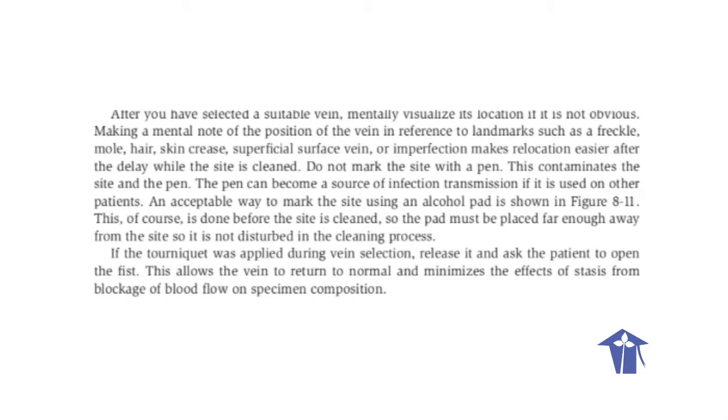After you have selected a suitable vein, mentally visualize its location if it is not obvious, making a mental note of the position of the vein in reference to landmarks such as a freckle, mole, hair, skin crease, superficial surface vein, or imperfection. This makes relocation easier after the delay while the site is cleansed.